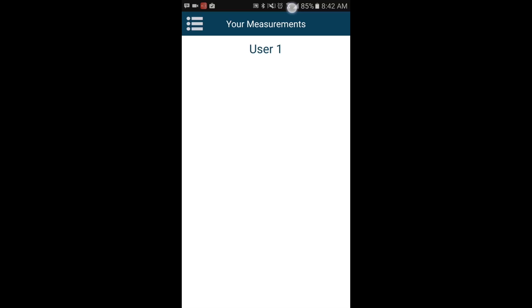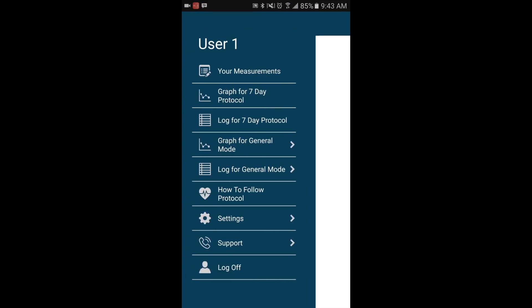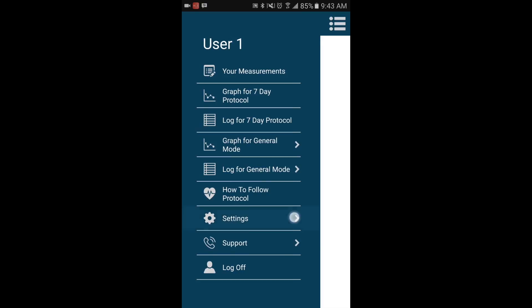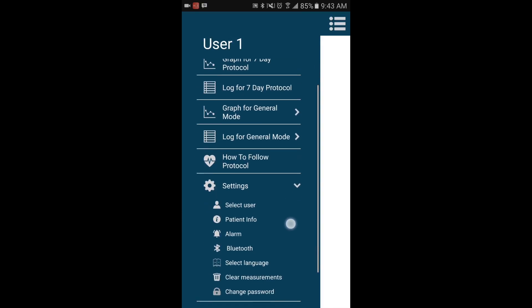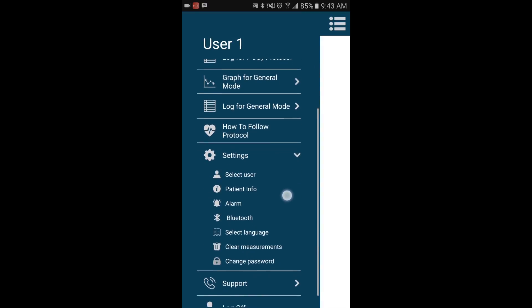Once you have initially logged into the app, the default username will be User 1 until it is changed. To change the name, go to Settings and select Patient Info.